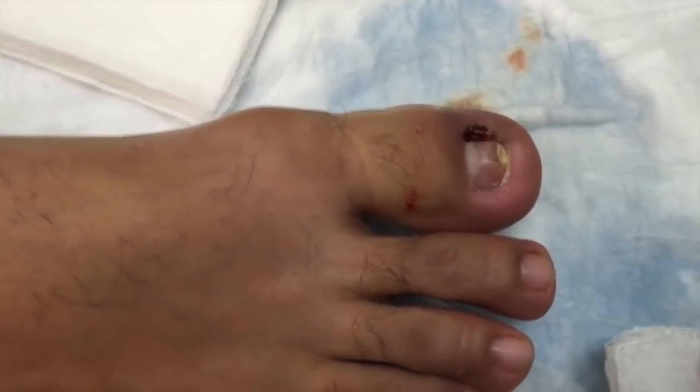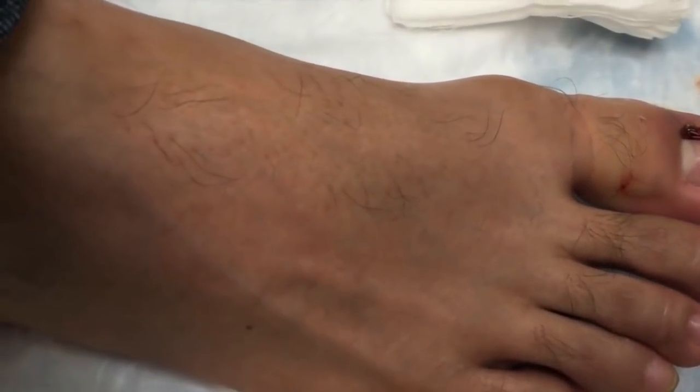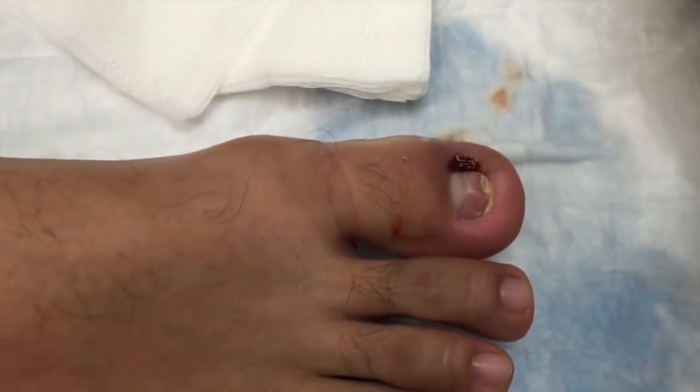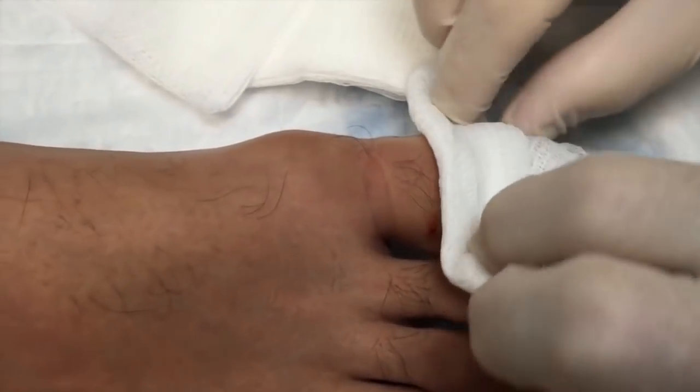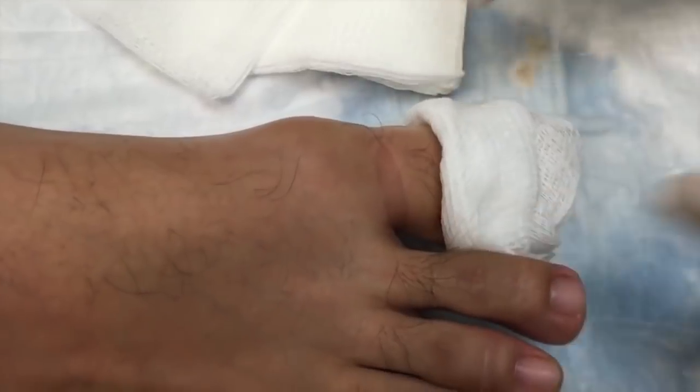Muy bien, amigo. You did real well. You did great. Any pain? Did it hurt? No. No pain? No, no pain. All right. So we're going to put a tube gauze with an Adaptec on here. And we're done. Good job, guys.